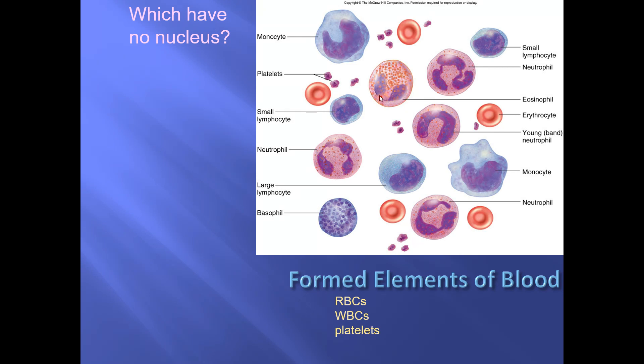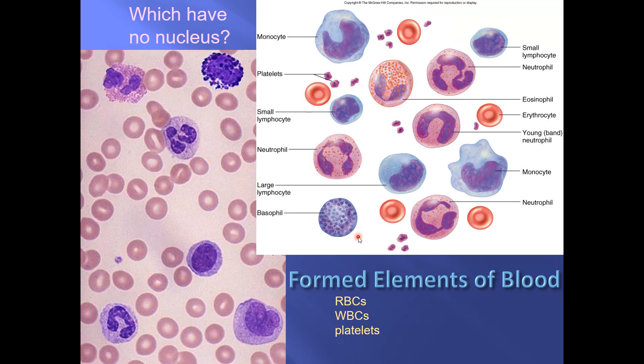Then there's this cell — you might not be sure if it's a neutrophil, but if you can see granules that are orange, pink, or red, you've got yourself an eosinophil. And if you look at a cell with lots of very blue or purple granules, medium in size, where you can't even see the nucleus — that's a basophil. Color is the last thing you look at. First, identify size, then the shape of the nucleus, then the shape of the cell, then granules. Color comes last.